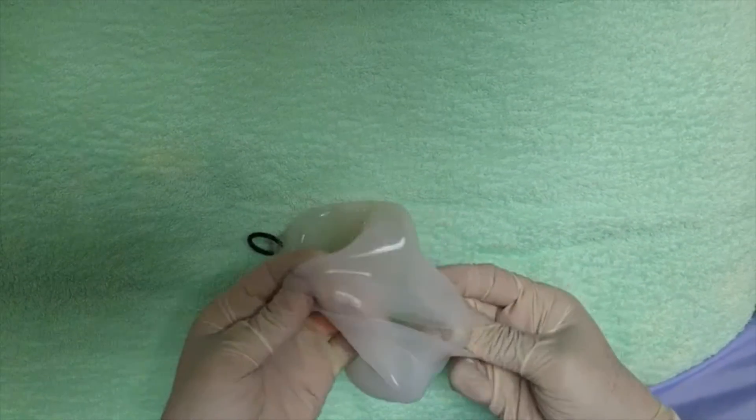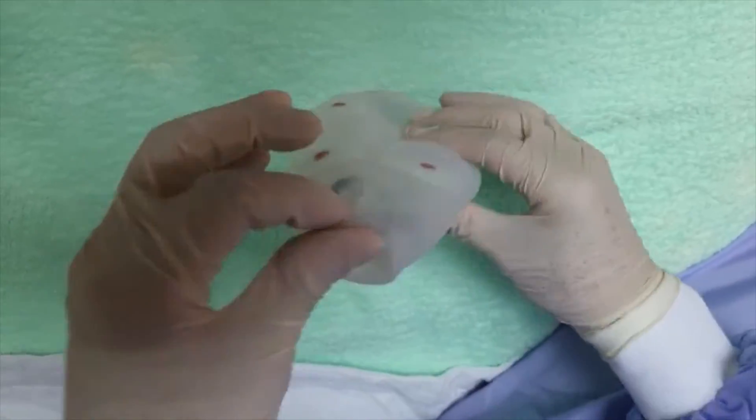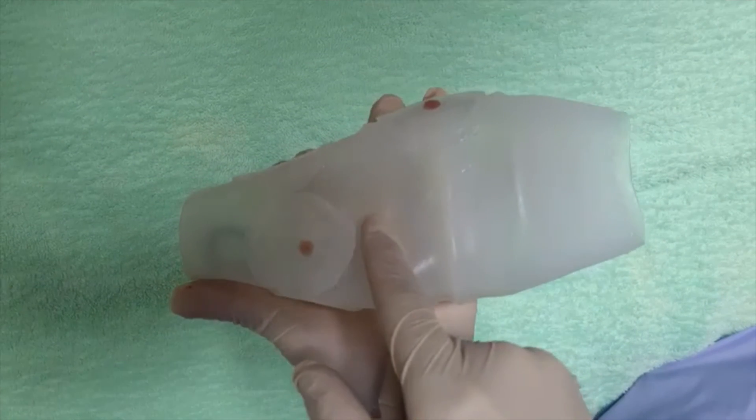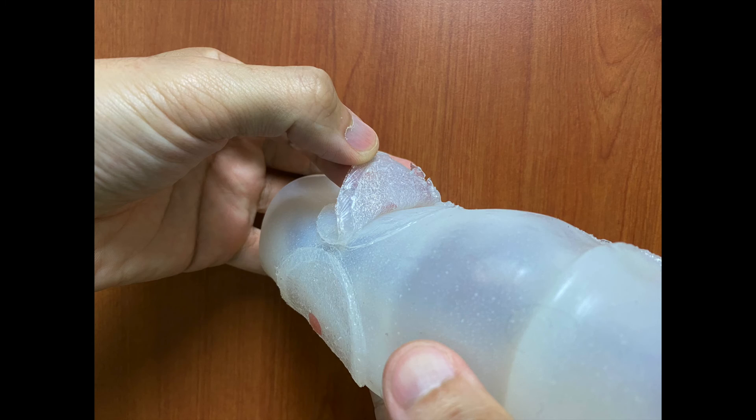First, we turn the plastic model inside out. Second, we chose one of the flat targets and separated it partly from the model wall to simulate the mucosa flap during ESD procedure.